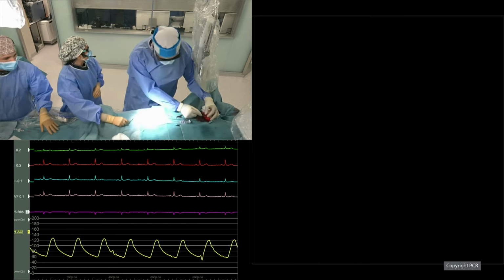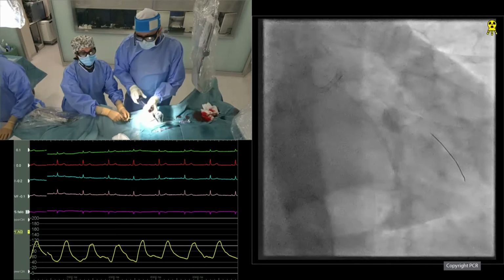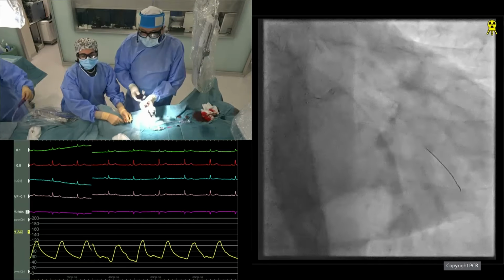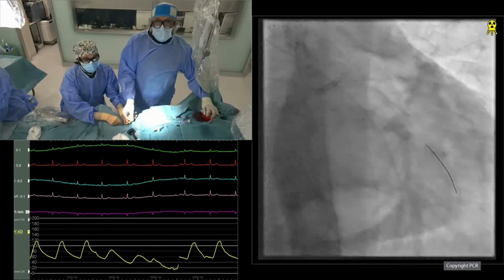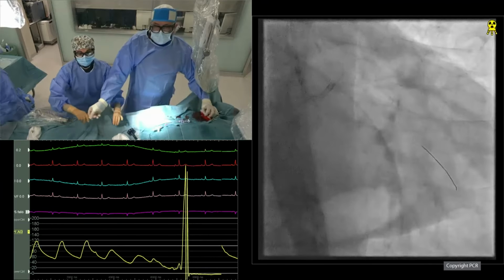The possibility when you are performing atherectomy, the chances of losing a side branch. Okay. Yeah, well, I would say it's probably similar to what happens with other atherectomy techniques. I think in general it's not a moment of high risk of losing the side branch. Okay. And I guess you had a good point to only do backward orbital atherectomy. You explained to us. Was there any gain in doing this also forward?